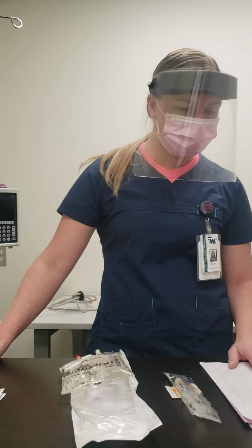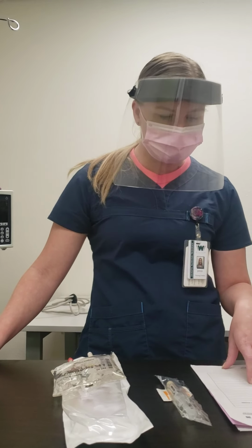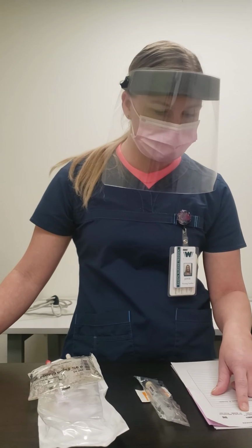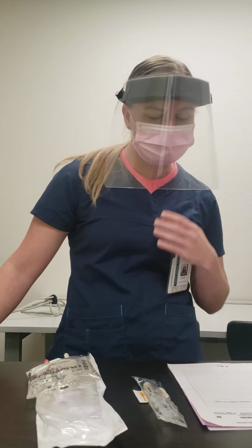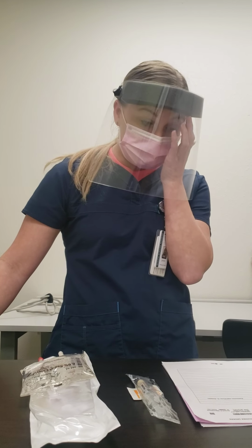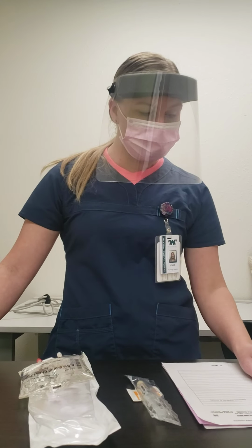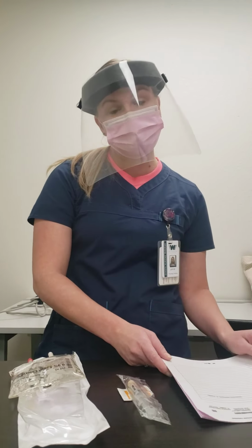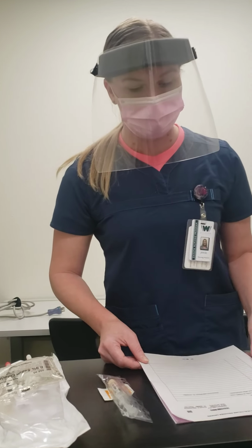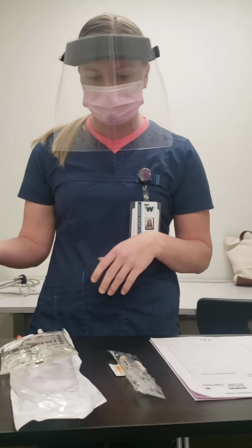So to get started, I'm in the med room, and I'm just going to start by verifying my healthcare provider order. So I have Samantha Lewis, 6/10/1975, and the provider has prescribed a blood transfusion, 2 units of packed red blood cells now, and an H&H 1 hour after the transfusion. I have verified that my client has need for this transfusion due to her low hemoglobin, and I'm just going to gather my supplies and enter the patient's room.